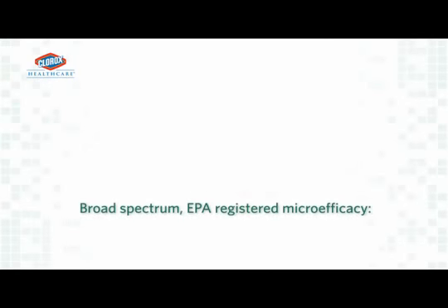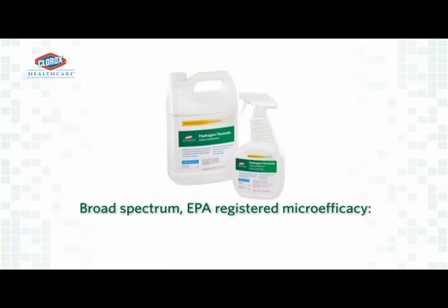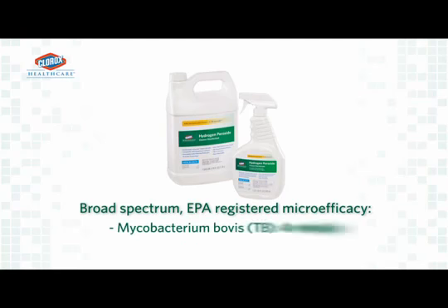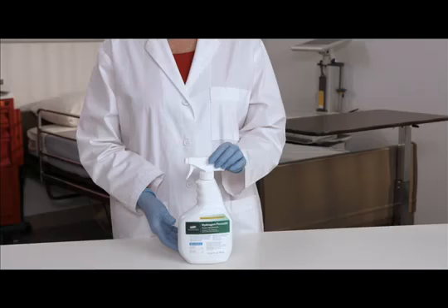Clorox Healthcare Hydrogen Peroxide Sprays are EPA-registered to provide fast, broad-spectrum microefficacy against hospital microorganisms: 30 seconds to 1 minute for most bacteria and viruses, including norovirus, and 4 minutes for Mycobacterium bovis, or TB.